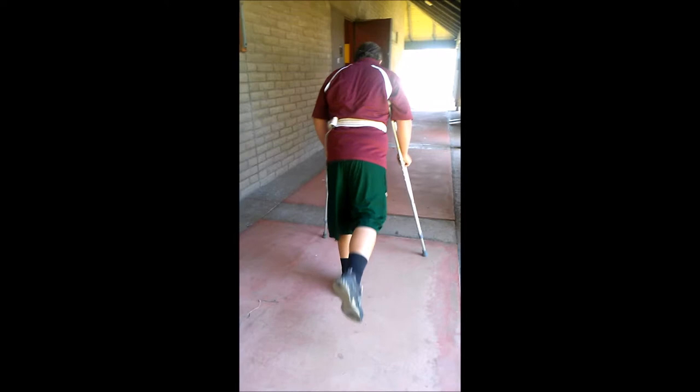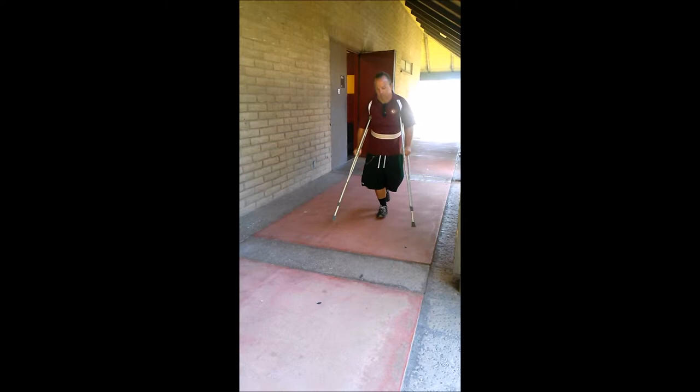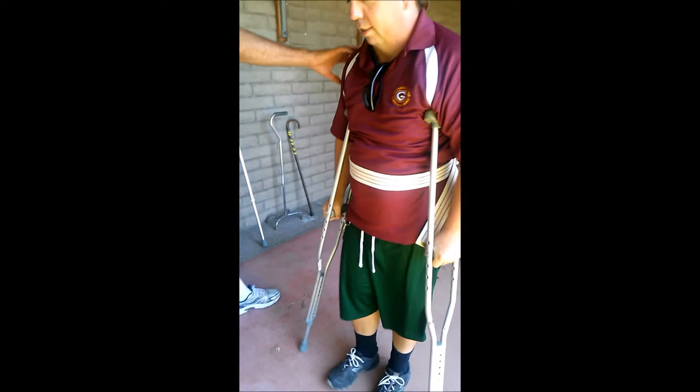Go back the other direction - keep doing that same thing. John is now demonstrating non-weight bearing on his right leg. Don't rest your armpits down - keep your arms strong. Come back this direction, swing that left foot through. John is now non-weight bearing on his left side. There are some balance issues associated with using this gait pattern.